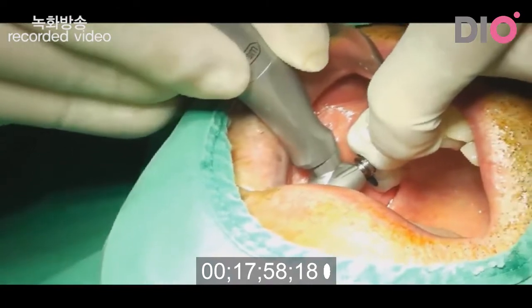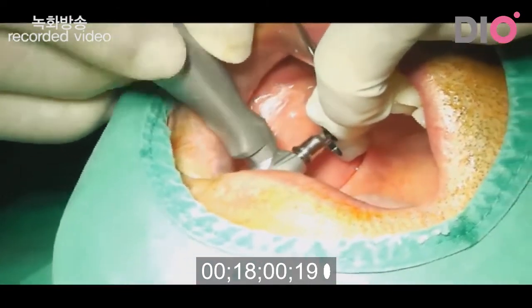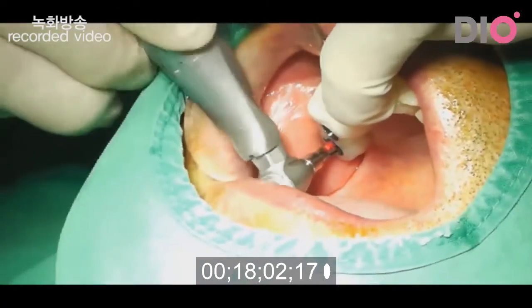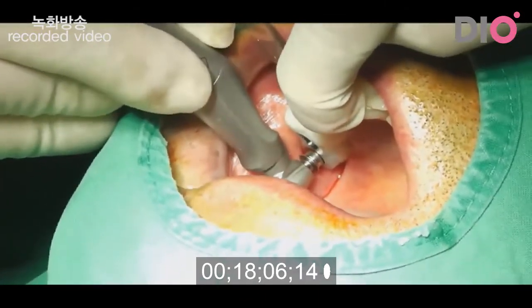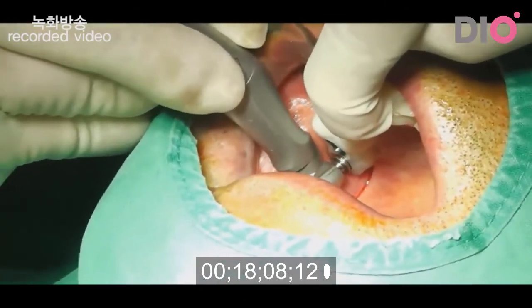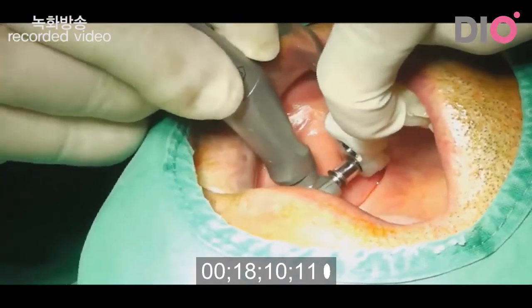Okay. Fully inserted. Yes, okay. In the second molar area, it's fully drilled.